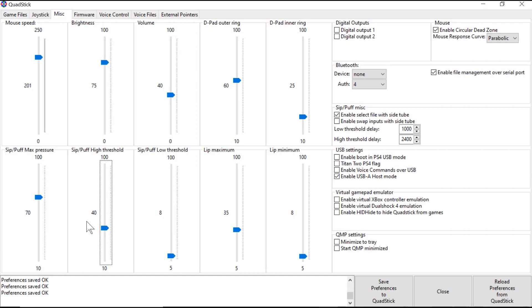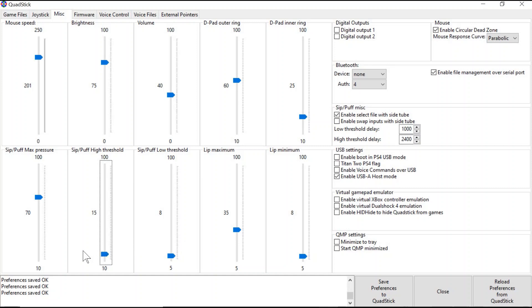However, for some individuals — specifically someone on a ventilator — this threshold might be too high for them to activate the controls, or they might have to use a lot of effort, making it exhausting to play games. Therefore, this might need to be lowered to a smaller number so they can activate the controls adequately without being exhausted or unable to generate the required respiratory force.